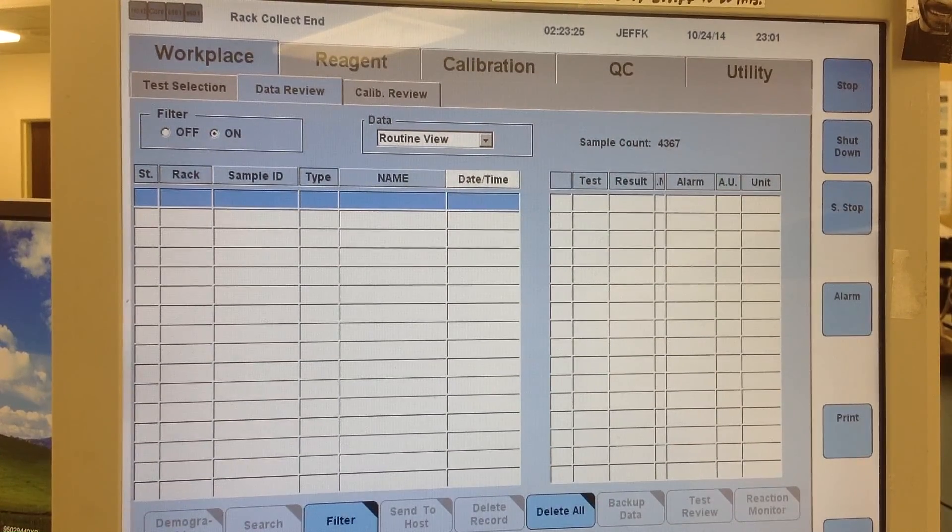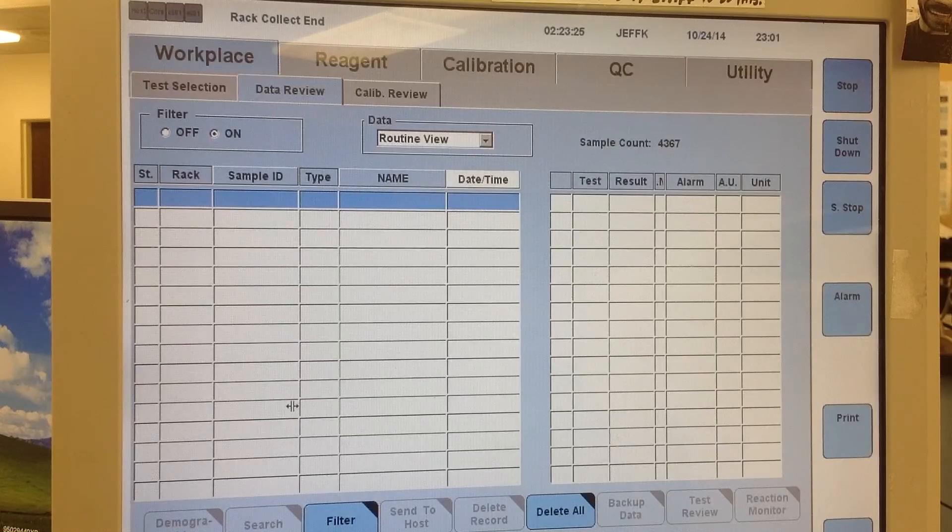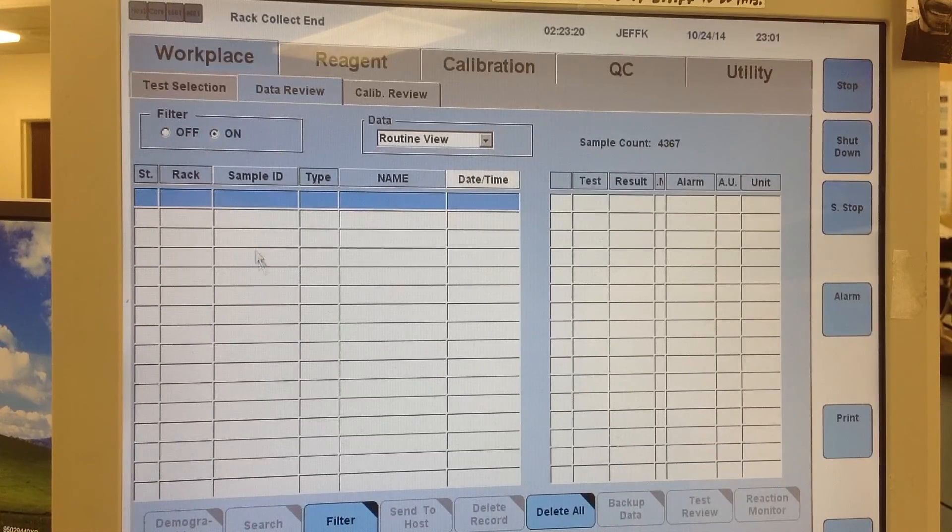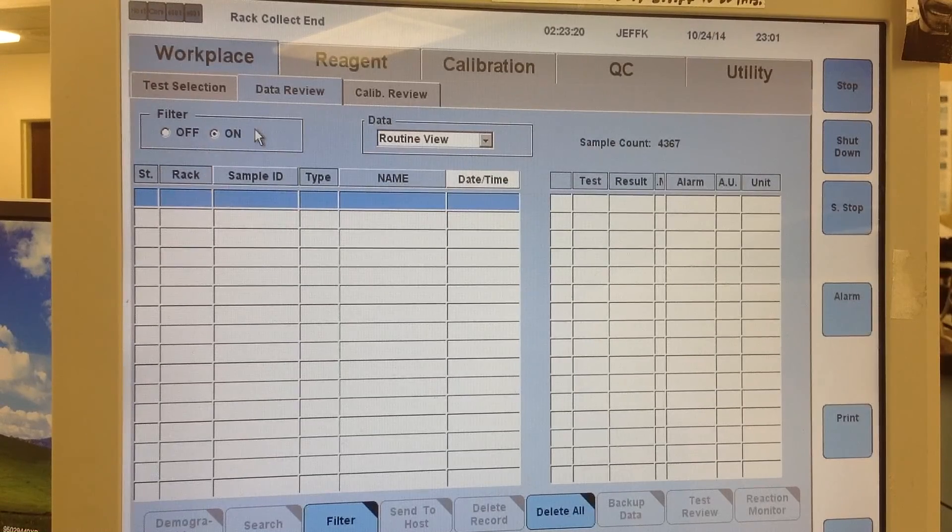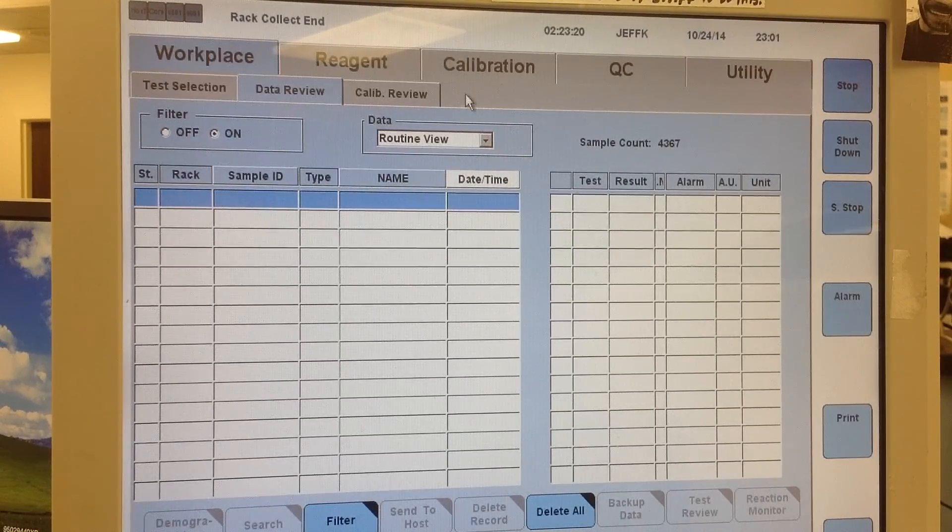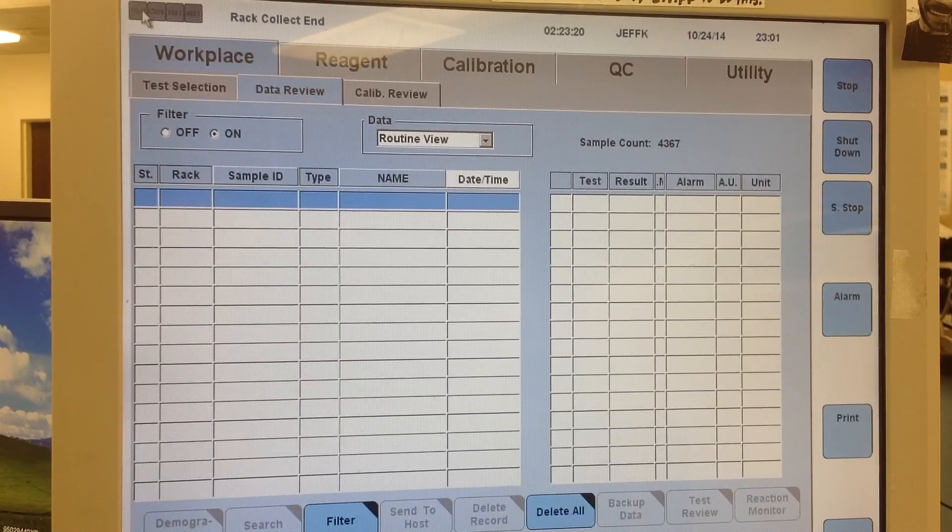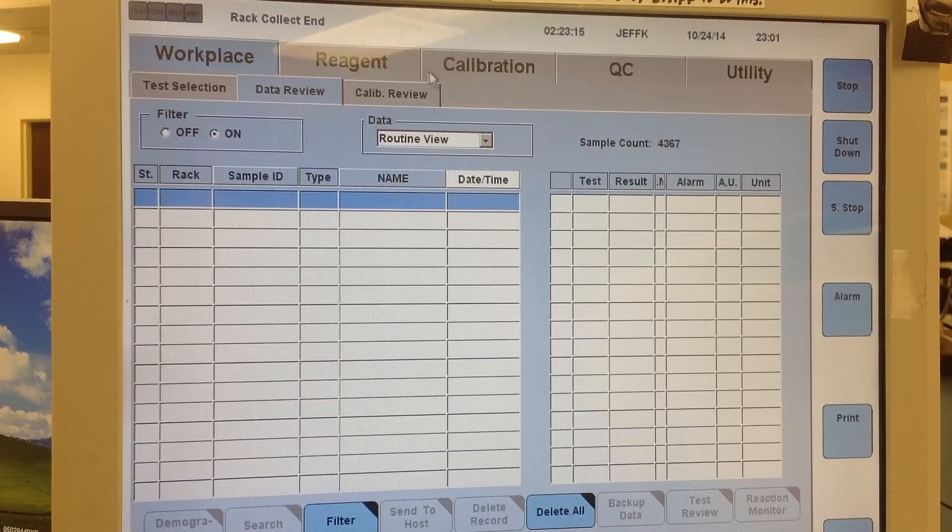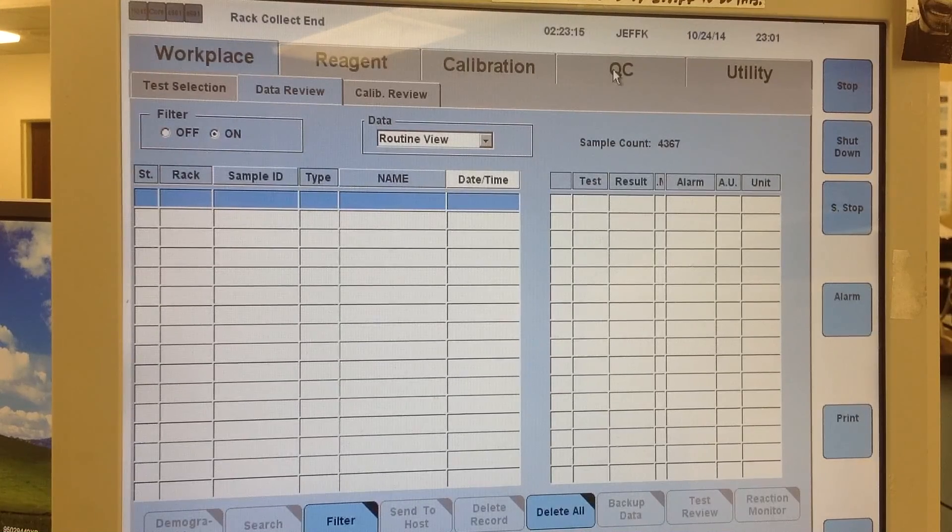So I wanted to make an additional video about ordering QC and calibrations. In the instance that you have to order specific QC and calibrations, and not just what the instrument recommends or all the QC, this is how you'd go about doing it.